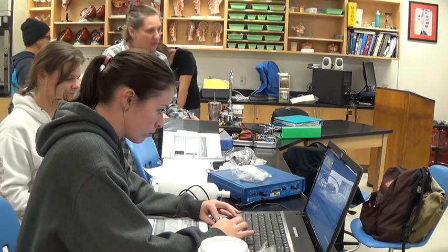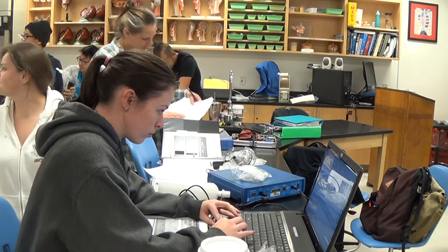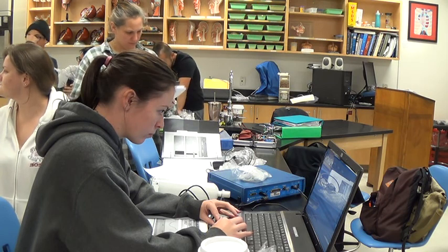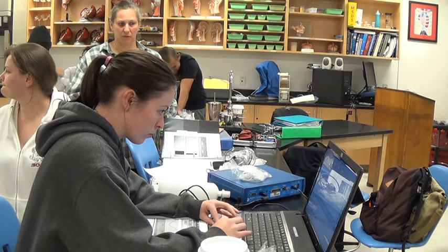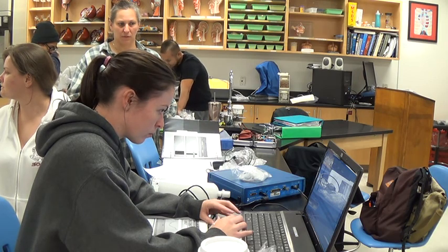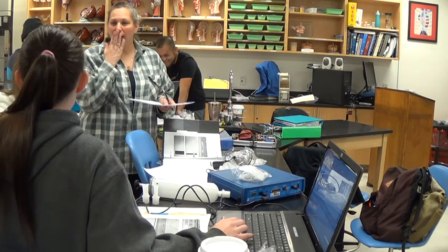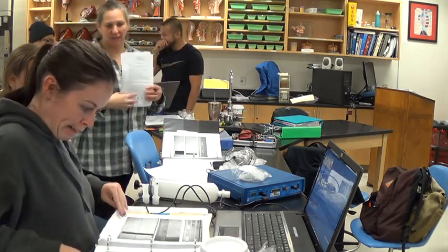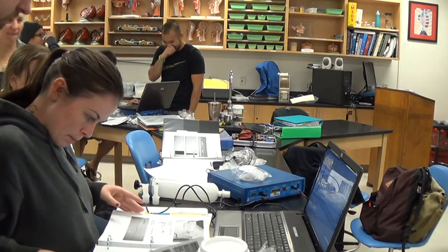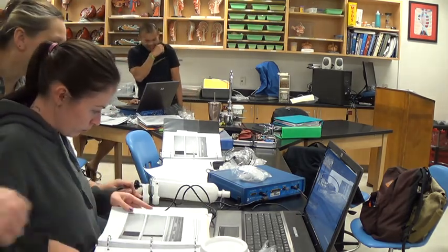Measuring right? Yeah. Normal. You're doing your FEV1, make sure you do delta T, not delta V. If you're dropping down the menu, you don't want delta V because that's volume; you want to do delta T so you've got seconds. That's what I was wondering. Delta T and delta V. That's why I said delta T. You're doing time, not volume, for one second.